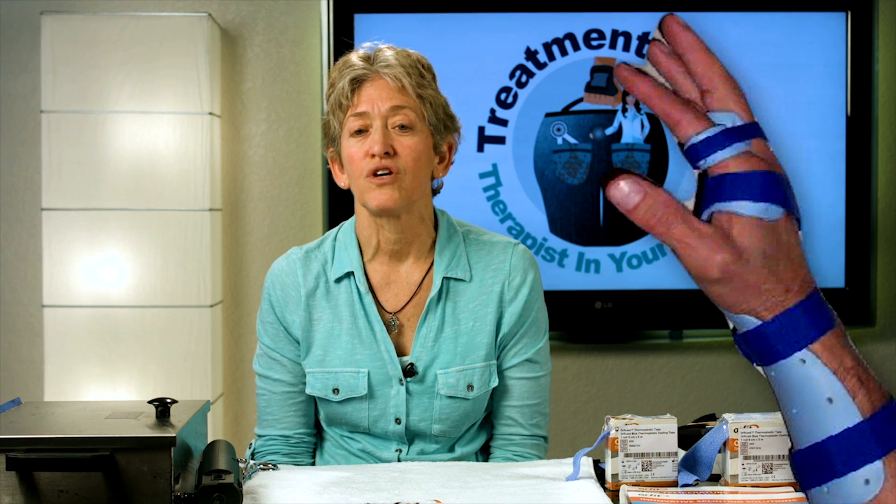Initially discussed in post-operative rehab of the extensor tendon injuries with the ICAM, or immediate active controlled motion protocol, this orthosis is now called the yoke or relative motion orthosis. It is one component of a two orthosis protocol used with a wrist cock-up orthosis, and is designed to hold one or two digits in relative extension compared to the adjacent fingers. It is useful in sagittal band injuries as well as extensor tendon repair protocols.